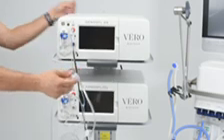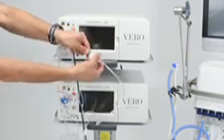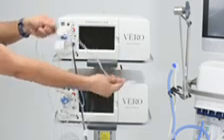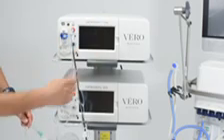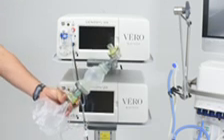Attach the barbed end of the manual ventilation bag NO adapter into the oxygen tubing from the manual ventilation bag. Connect the manual ventilation bag NO adapter to the oxygen source. Place the manual ventilation assembly in a clean, accessible place if needed for future use.